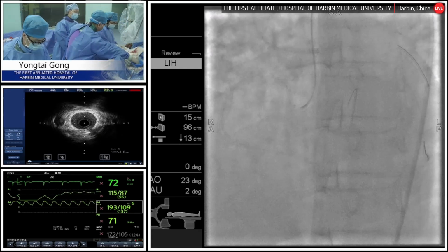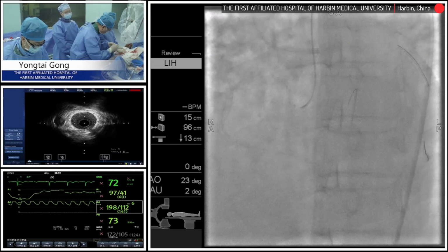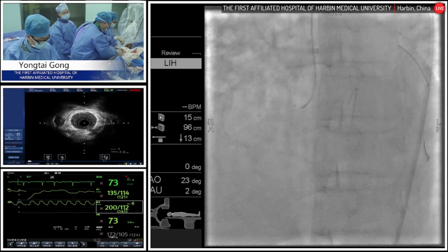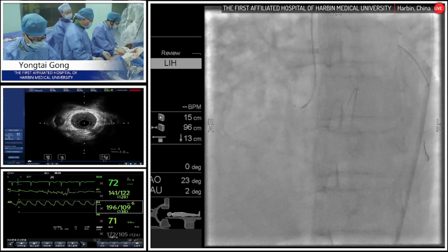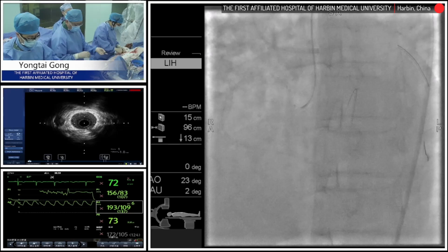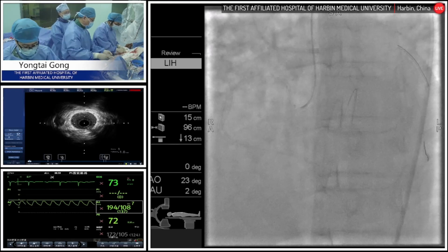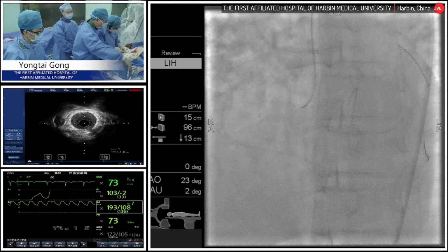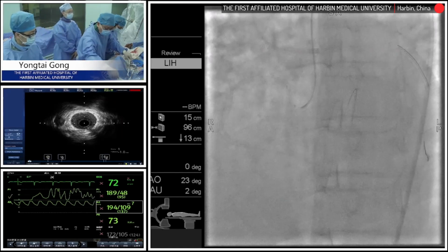Another very important piece of information in this patient is the plaque composition in the CTO segment, for which we applied the 3D reconstruction software to detect the majority of the CTO segment. There is no severe calcification. I think this is good information for this patient because we need to avoid severely calcified segments, which make a high risk puncture into the subintimal space more likely.